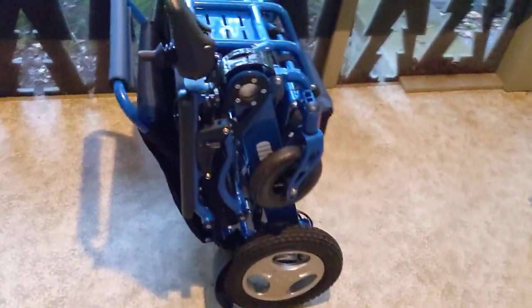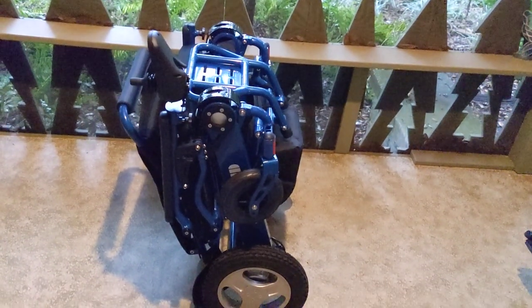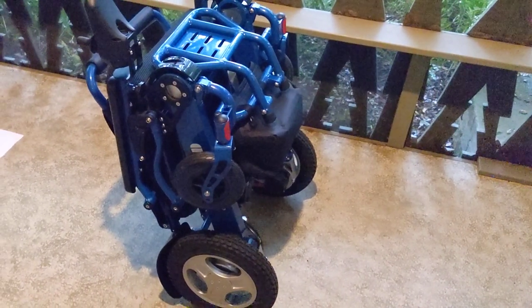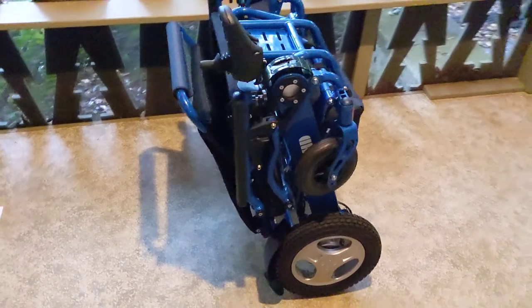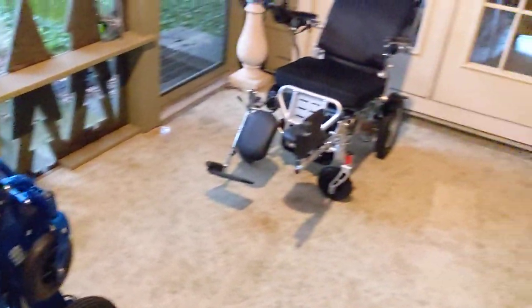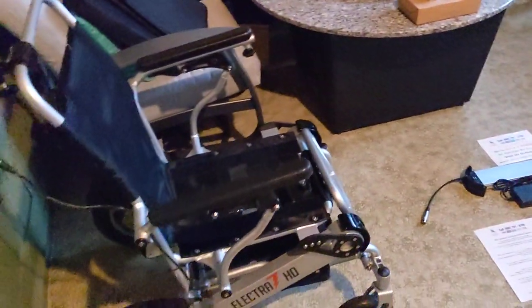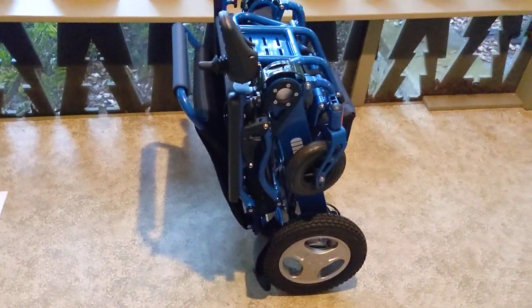A lot of people wonder how the actual footprint of the chair is. Folded up with two batteries in, the chair weighs 58 pounds, and it is an FDA-approved medical device, FAA-approved for travel. We've got a couple other chairs that we're going to show you some of the different features, but mainly we're talking about the Eagle.